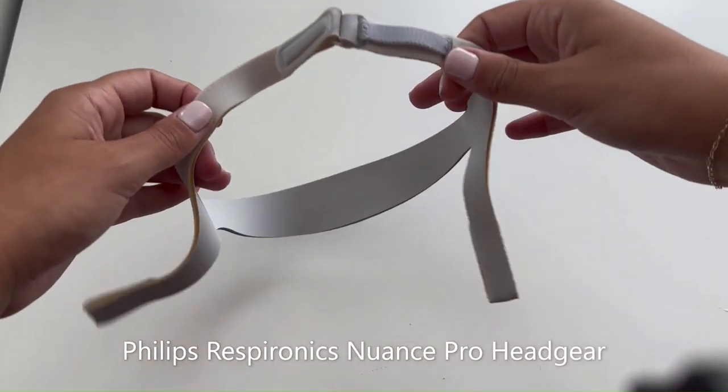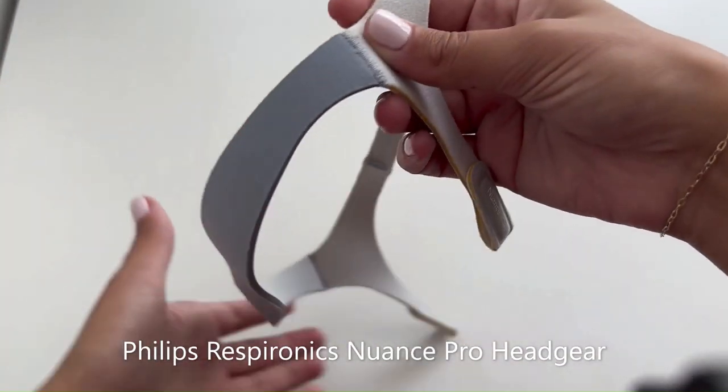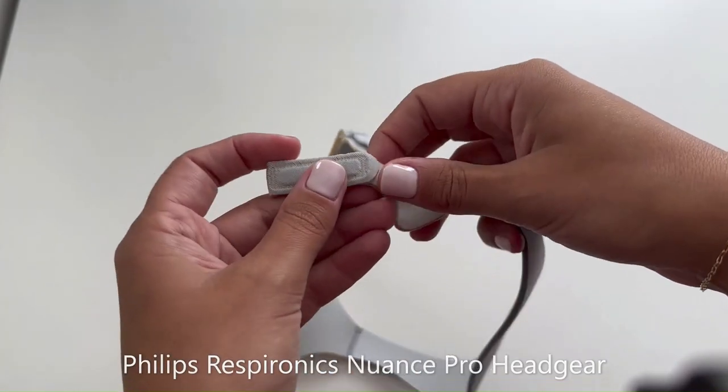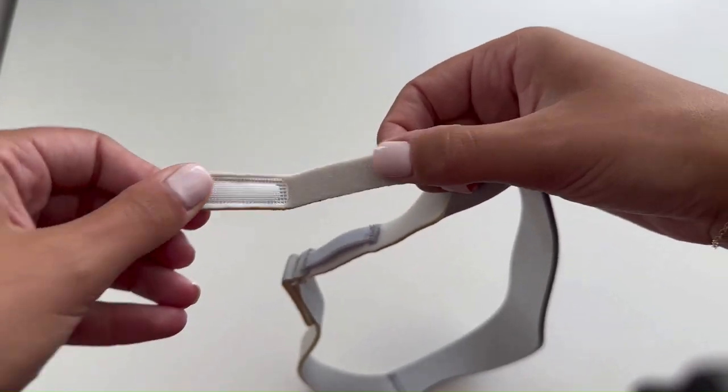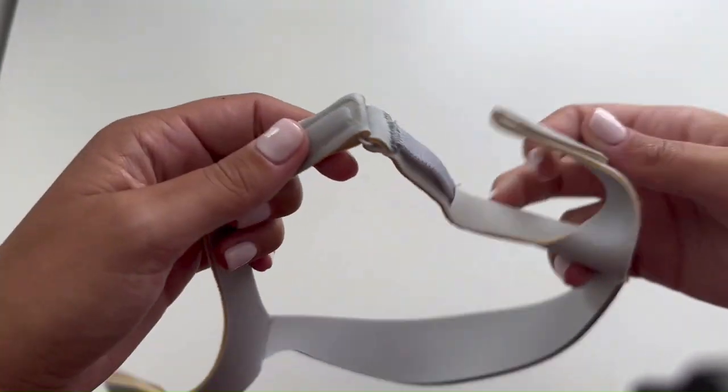The Philips Respironics Nuance Pro Headgear features four points of adjustment to help CPAP patients find their most customized fit. These adjustment points use Velcro tabs to easily adjust your headgear.